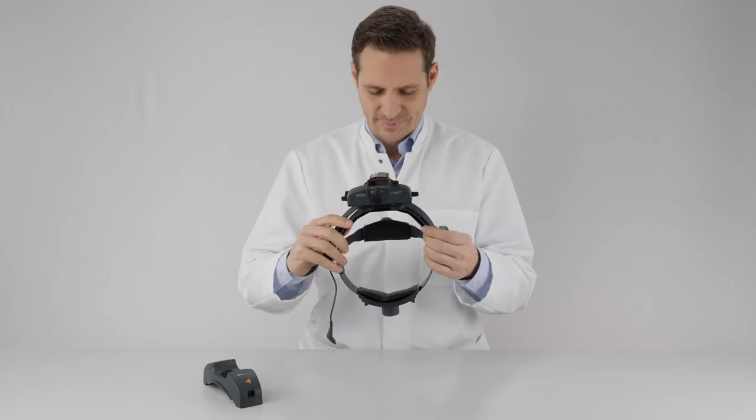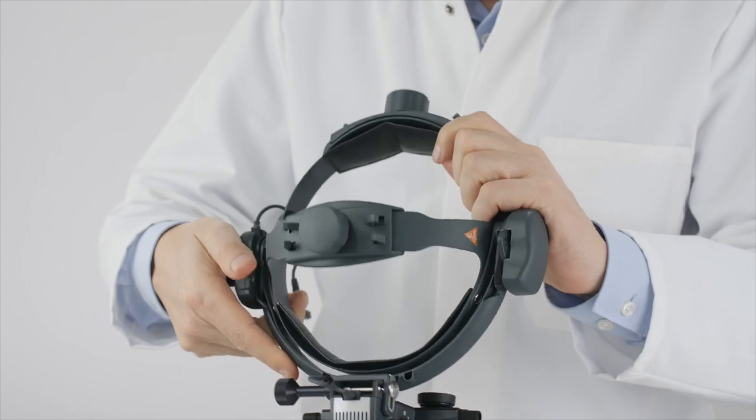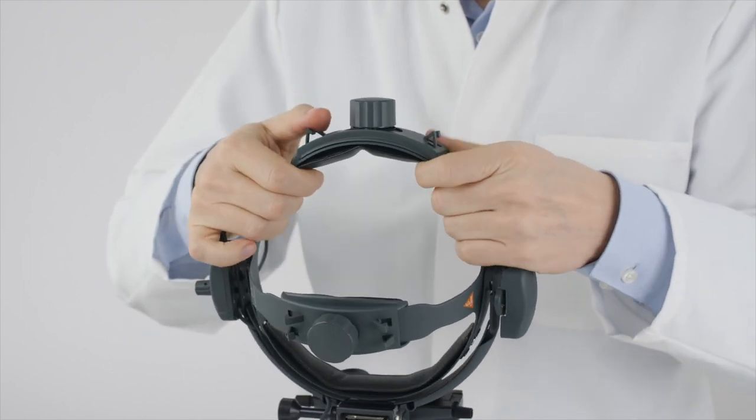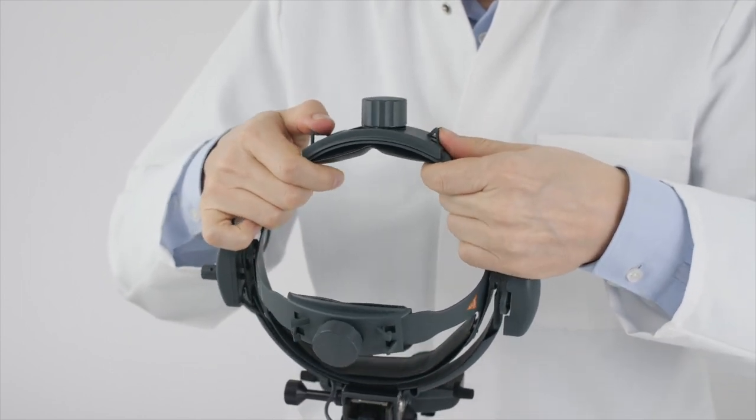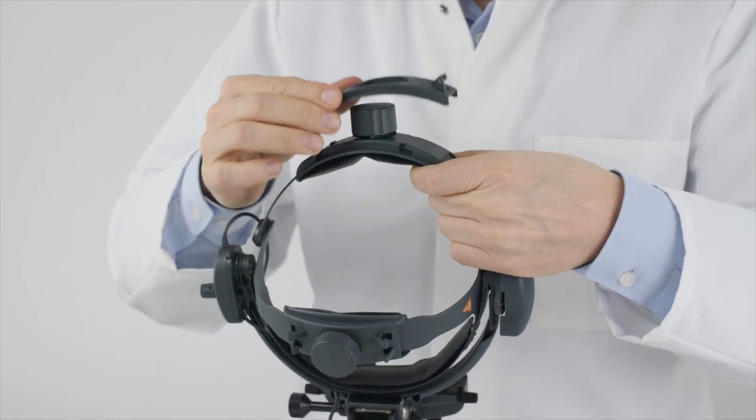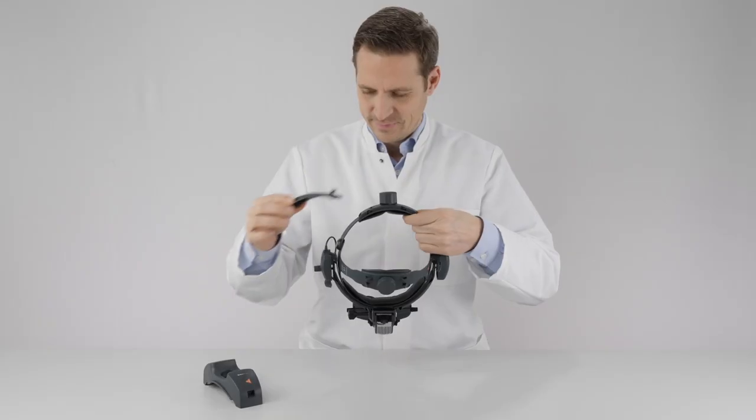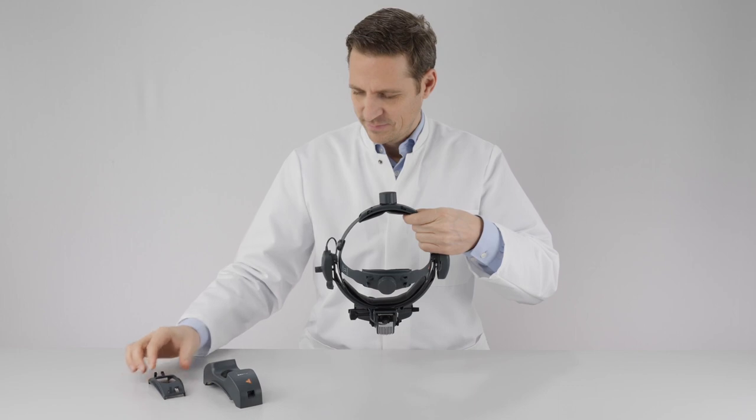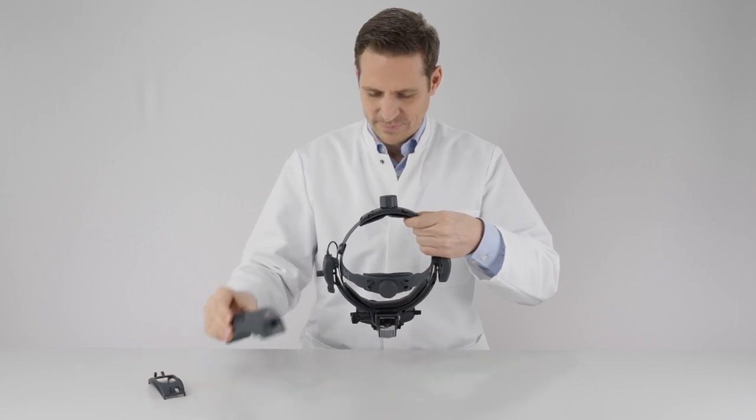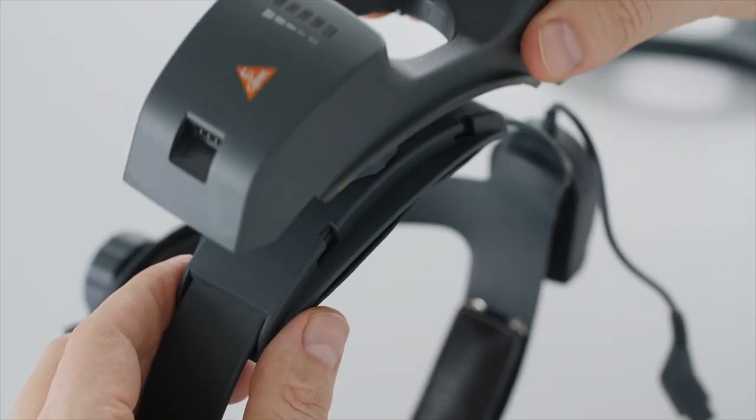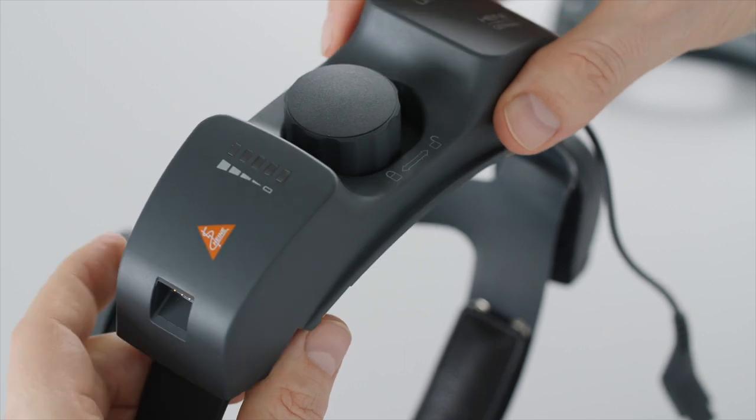First, the rechargeable battery. To prepare the Omega 500 for use, attach a charged MPAC unplugged battery to the headband. If necessary, remove the segment cover from the headband. Then insert the battery and slide it to the left until it latches audibly.